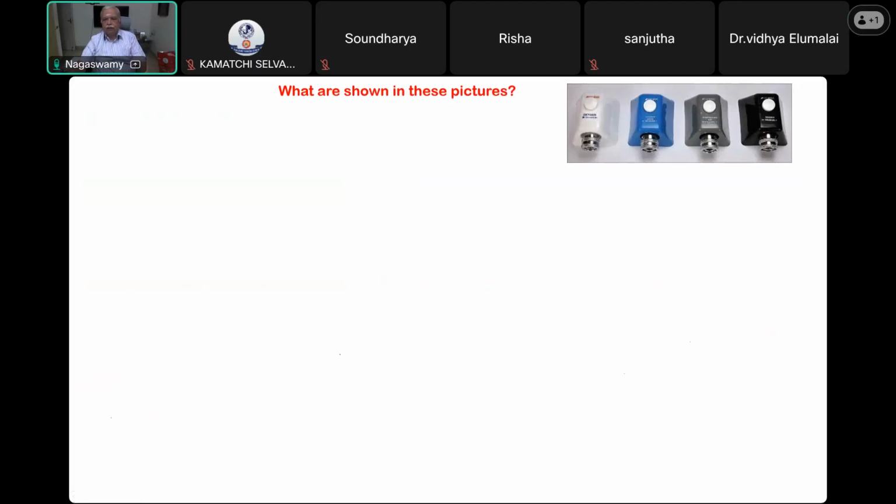This is also a very common question in the exam. You have to be very careful in saying that. So color-coded wall outlets with self-sealing valves, which are also called Schrader valves. So when you remove the hose, the probe which is going inside, automatically a disc will come and close that, so that no gas will leak out. That is why it is called a self-sealing valve.